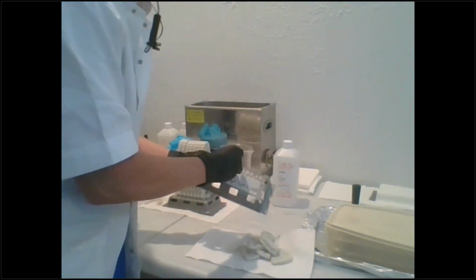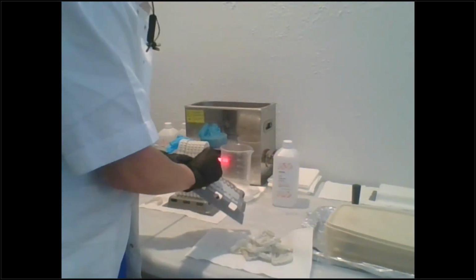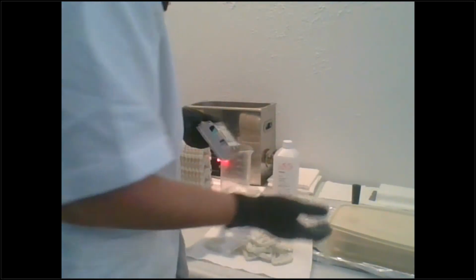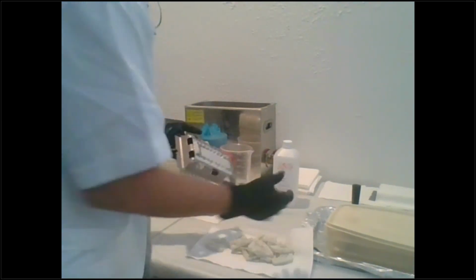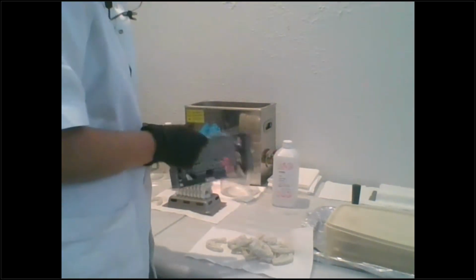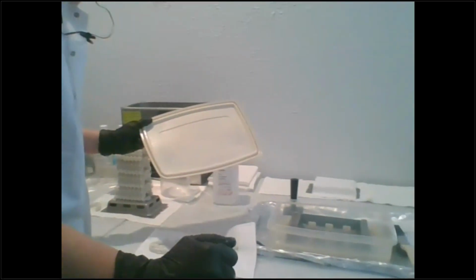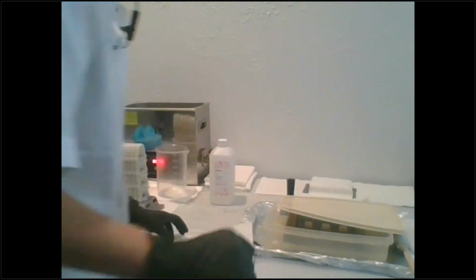And this was a really, really short arch, so I was able to fit 10 on there, which is awesome. It depends really how conservative you want to be with your material. So then the next thing that I do is I put this into my build area that I just showed you, that build platform holder in here, and I'll come back to that.